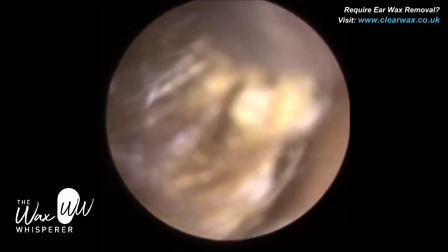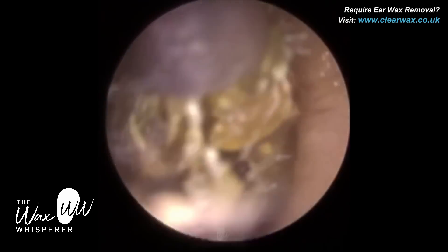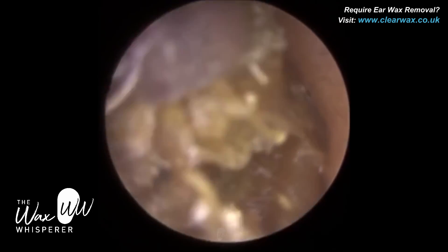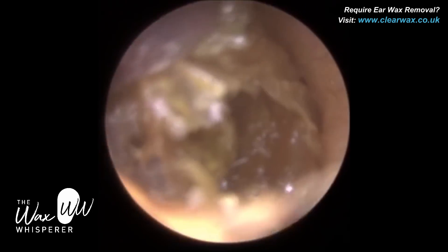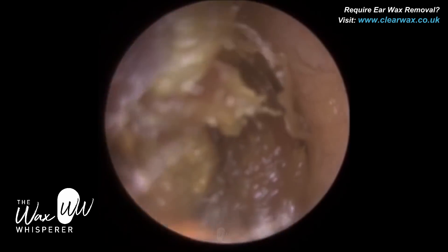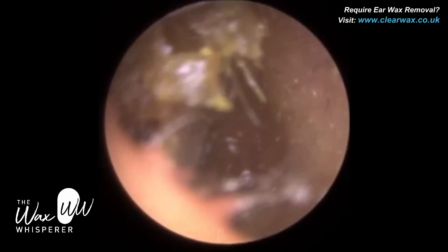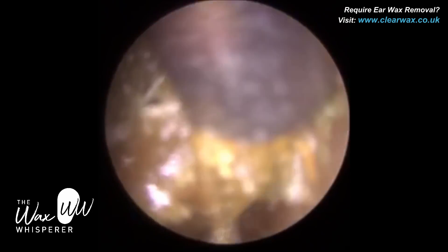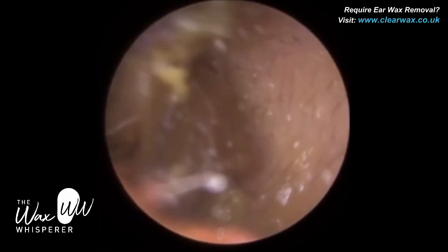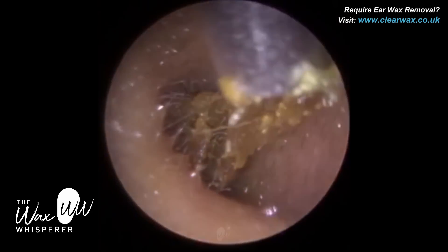You can see the skin — the glossy outer layer of this plug of wax — that's dead keratin, and it's engulfed the wax. This keratin acts like double-sided sticky tape: it sticks to the ear canal wall and also adheres itself to the plug of wax. We're right near the entrance now — I'm just turning this to the right so we come out of the ear canal. A tail of keratin got suctioned through — there we are.